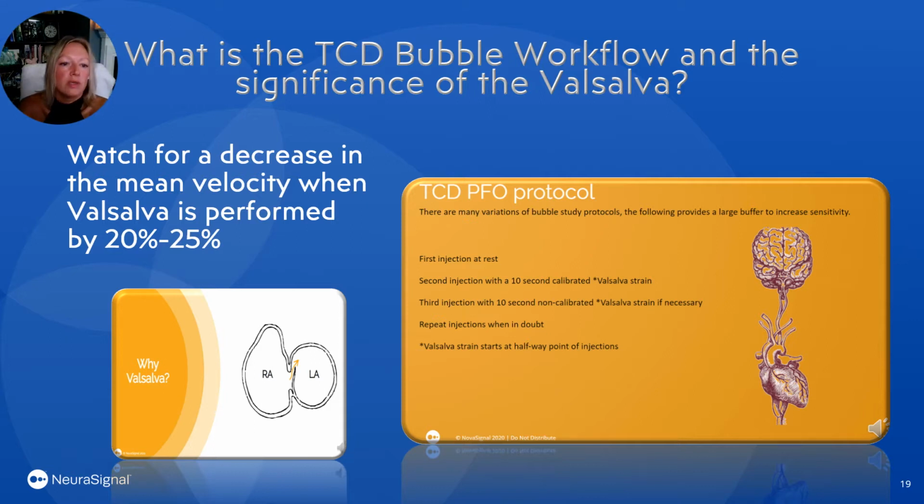So what is the significance of the Valsalva? As we mentioned, the PFO may not be an opening. It may be a flap. And in this case, that is why they are commonly missed on TTE. So when it is a flap, the Valsalva will open up that flap.